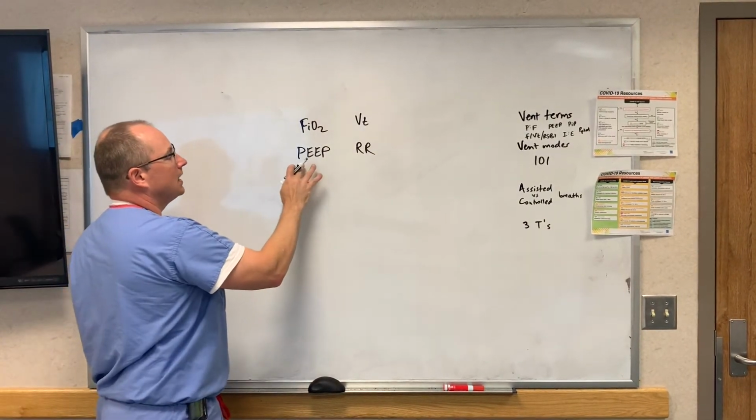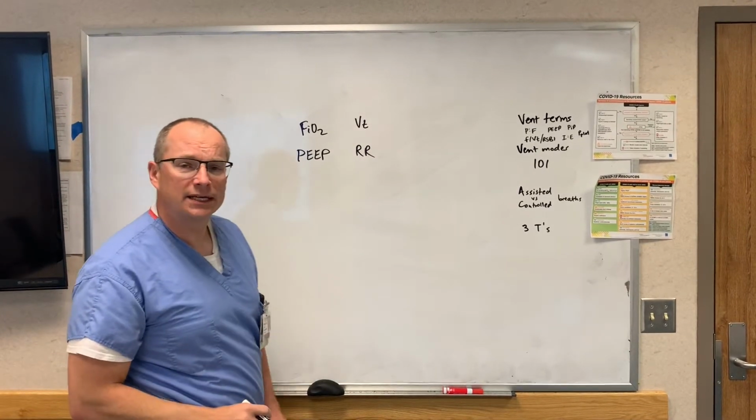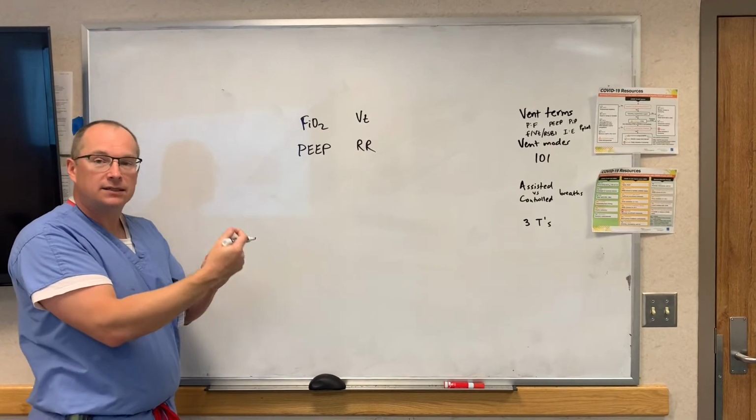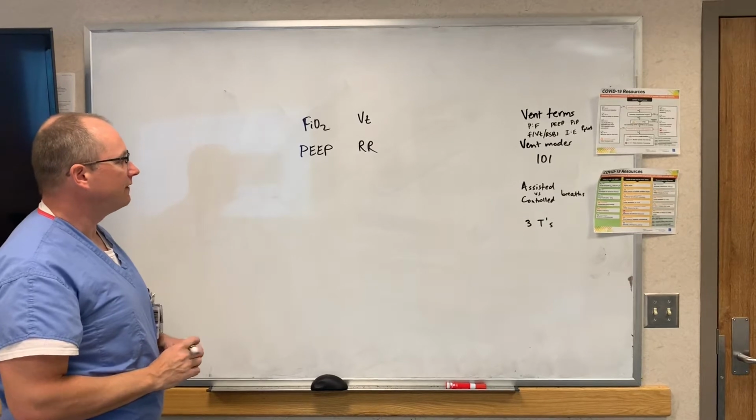The PEEP is positive end expiratory pressure. Once again, positive end expiratory pressure. It's the pressure that is present at the end of exhalation, at the end of a breath on a ventilator.